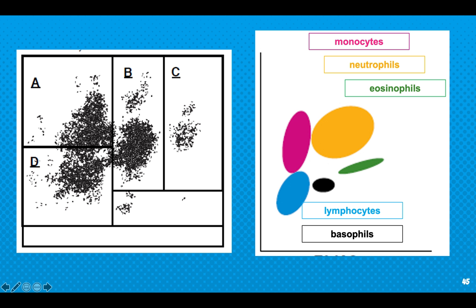So I hope I'm really getting through with this. I hope I'm really communicating how it is being read. If you have any questions, just comment down below or wait for me when I go live tonight. So, your monocytes, your neutrophils, you have your lymphocytes.